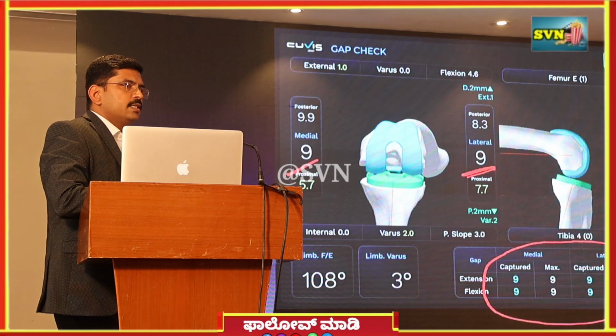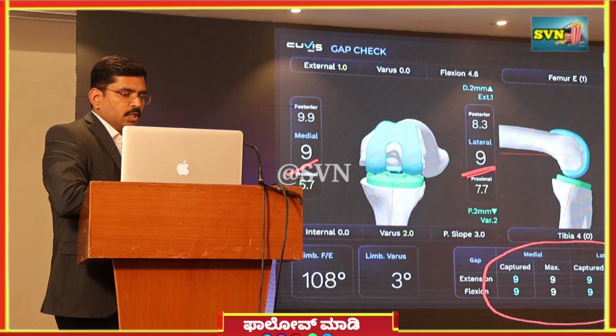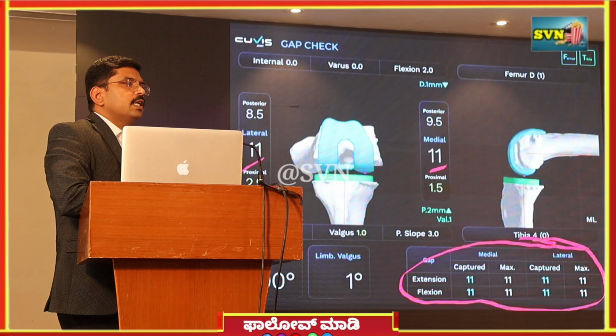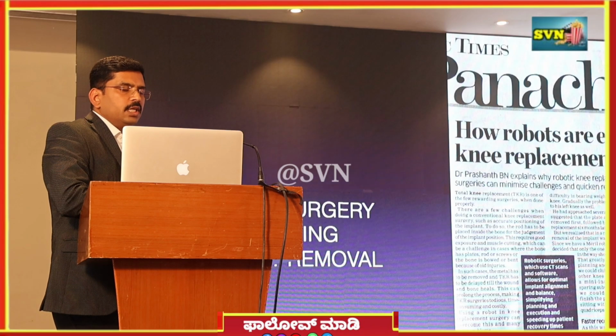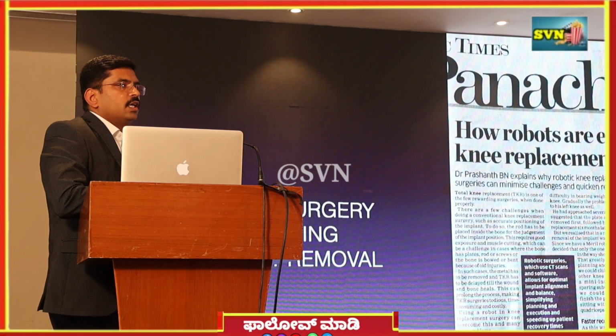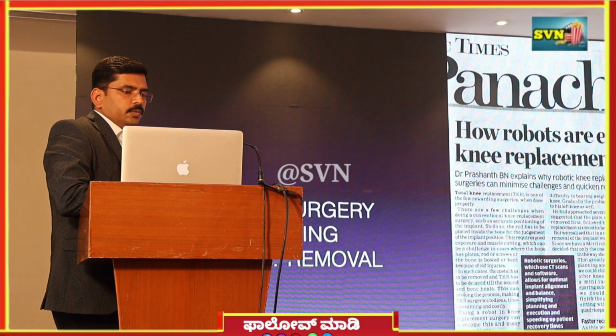So the balancing is very good. Then definitely, since the balancing is good, the patient's activity will become pain-free. The same thing, we can increase the bone resection if there is a bone defect. Then also we can balance it comfortably. The same thing I had explained in an article about what are the advantages of using a robo.